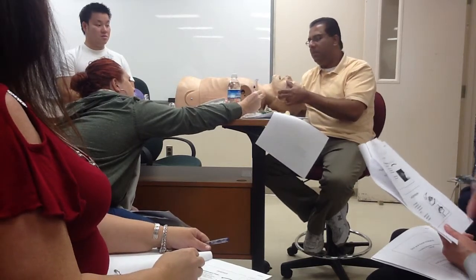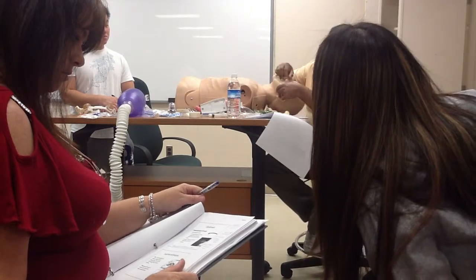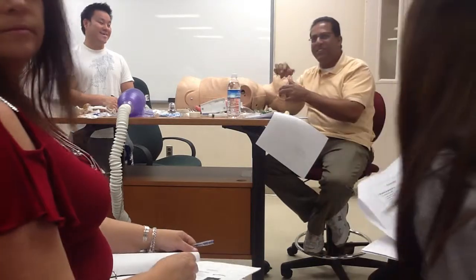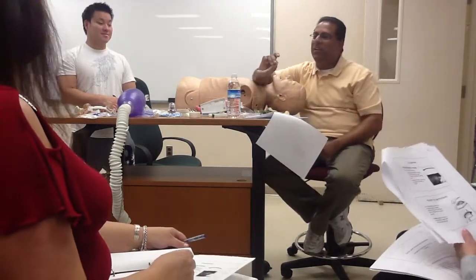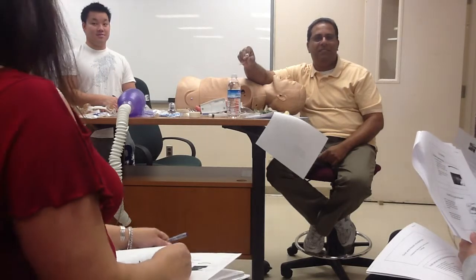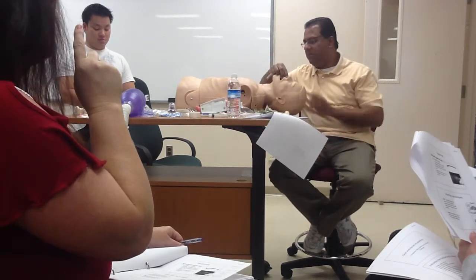That's what it typically looks like. It's going to the middle of the naris by textbook definition. But that'll also be better tolerated. The only issue with this one is, look at the catheter, it's too narrow if you want to suction. Okay, just tell me this, when you're saying the middle, you're saying the center of the nostril, or are you saying the middle of the nose? The center of the nostril.